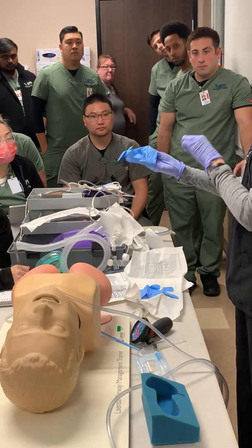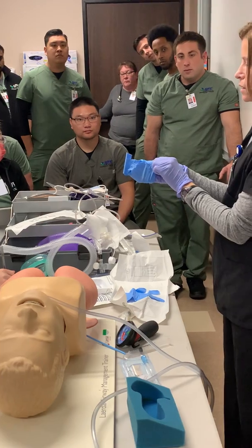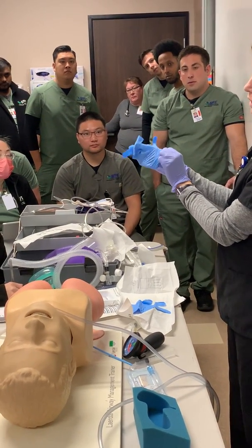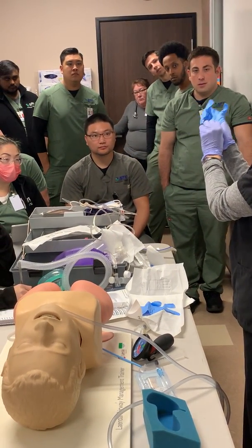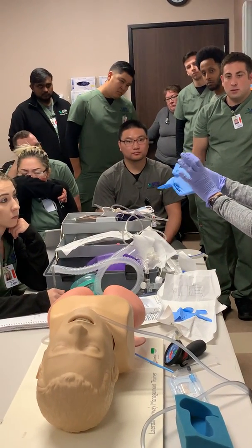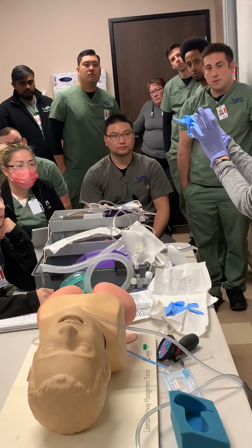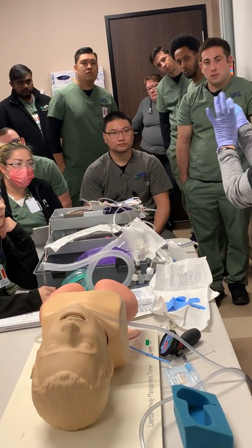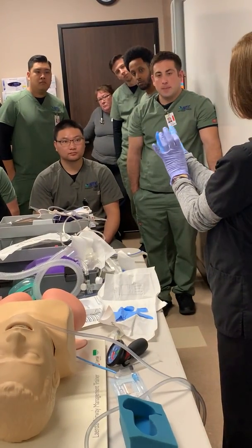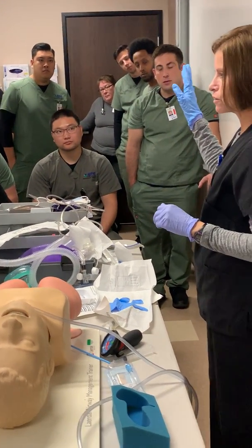One of the hardest parts is finding where the finger holes are. So if you are doing this, don't worry, you can hold out here on the side that's still folded back as you find where to put your fingers. And if you get more than one finger in a hole, you're still just reaching under and stretching it on. Okay, so now this is my sterile hand.